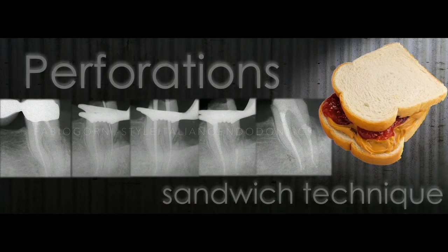These cases were referred to me by colleagues because the tooth had some problems, and the patient, after a surgery of the wisdom tooth, started to have problems and pain on this tooth. The colleague tried to treat the lower molar, but in the distal root he got some problems. So that's why he finished the therapy in this way. I removed all the material in the distal root, but in the intra-op X-ray we can clearly see the lesion done by the burrs during the surgery, that created a problem from the external surface of the root in this molar.